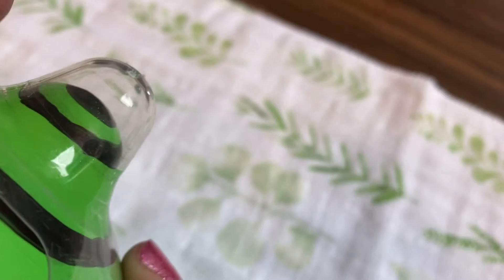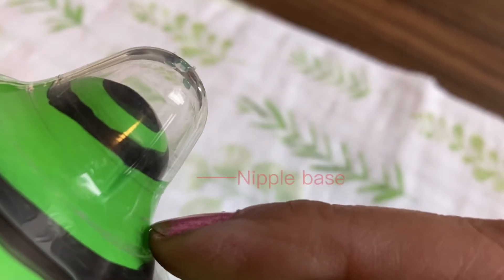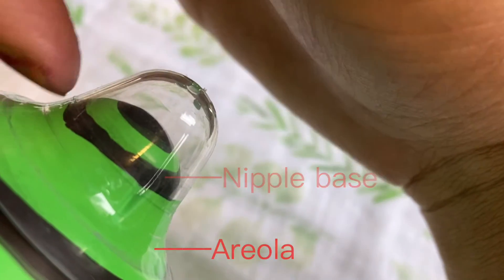Here you'll see how we avoided the base of your nipple — that second black line — and the edge of the cone of the shield made contact with your areola.